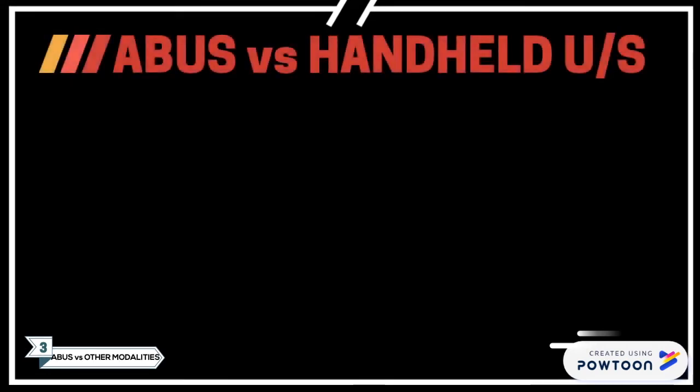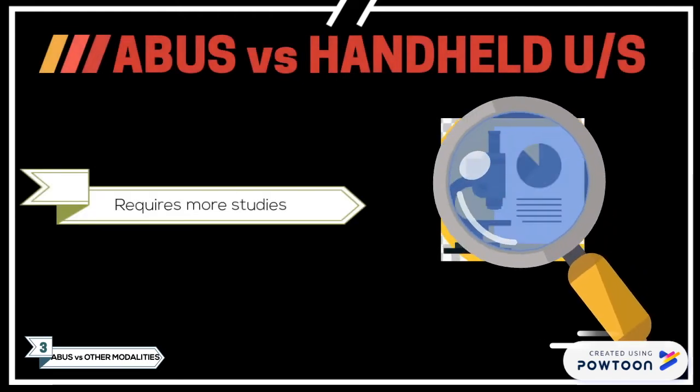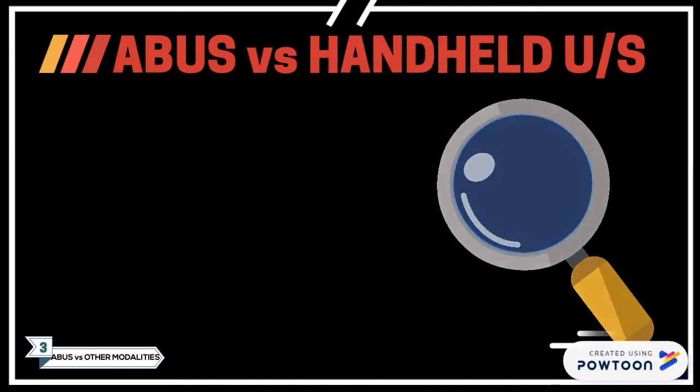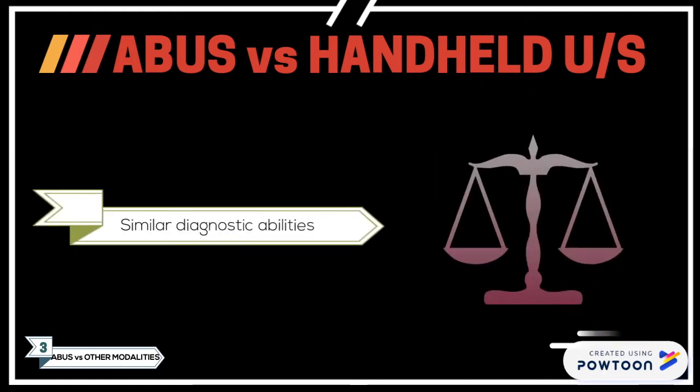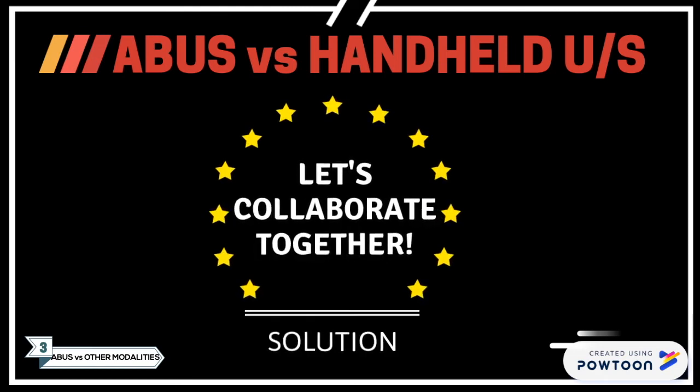Overall, it can be noted that there are not yet enough studies to conclude that one modality is better than the other for diagnostics. What has been found so far is that they have similar abilities, and instead of eliminating one over the other, we should be pairing them for improved imaging.